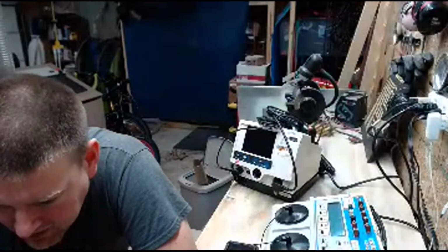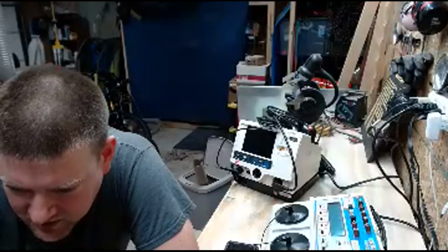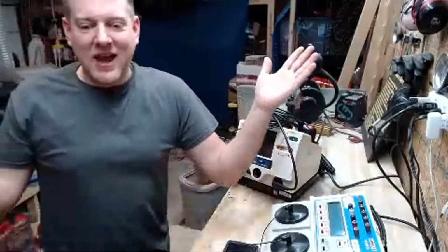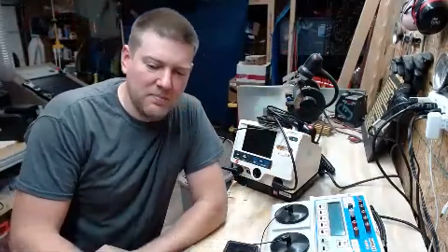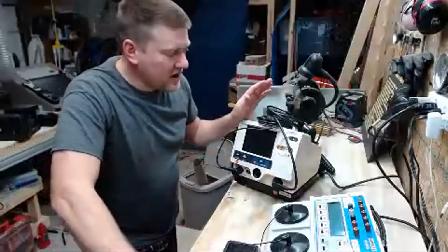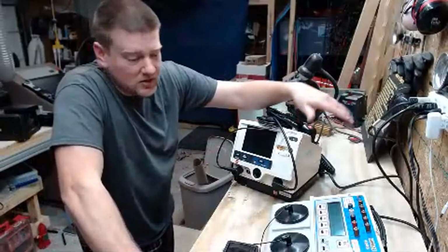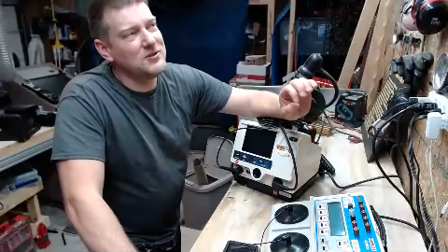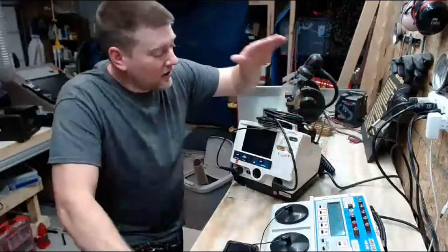Yeah, not a good thing if a defib can't shock in an emergency. Just had a LifePak 20E show some funky errors during a PM under warranty, so I shipped it out. CYA, guys. CYA. They also say it's the cost of doing business, all right? Your hospital might not want to ship it out because it's going to cost, what, $800, maybe $1,000 for them to do a PM inspection. It doesn't matter. Even if it costs $4,000, that's a drop in the bucket compared to litigation expenses when a patient's involved. Ship it out.